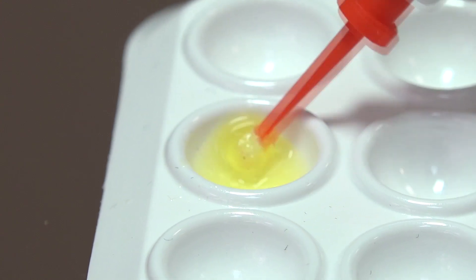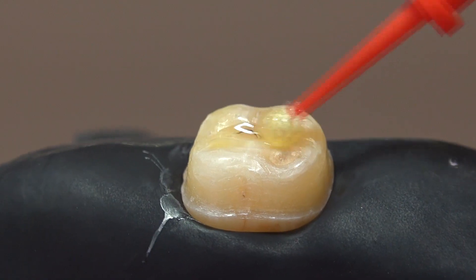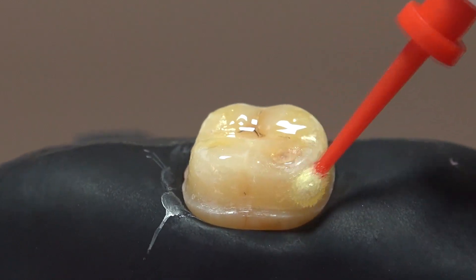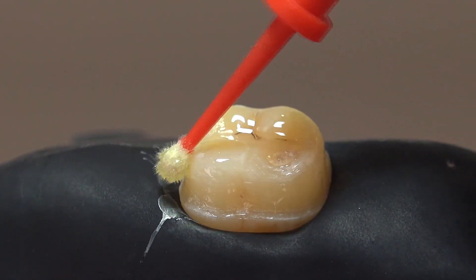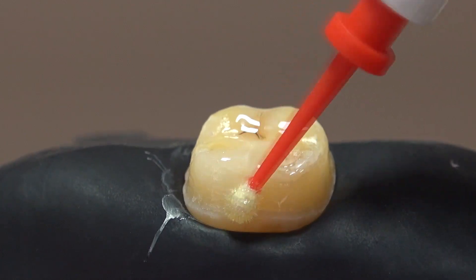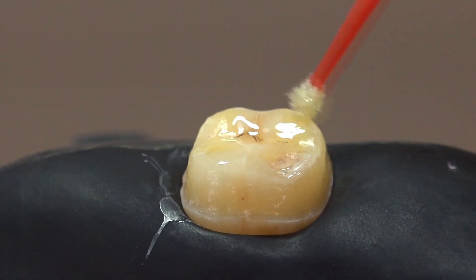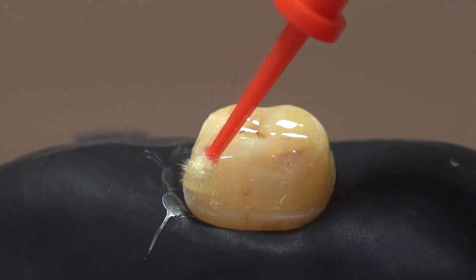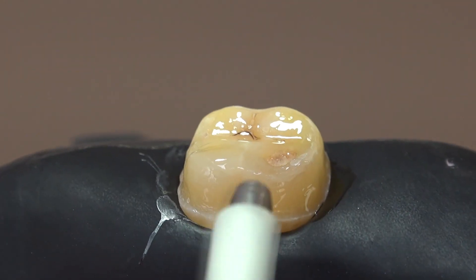We will then apply a 50% filler rate viscous adhesive layer, applied only on the dentin surface. In clinical practice, we avoid enamel at the margins as much as possible, although it is hard to implement. The methacrylates in its chemical composition are very durable. We air thin from the margins to the occlusal surface and light polymerize this layer.